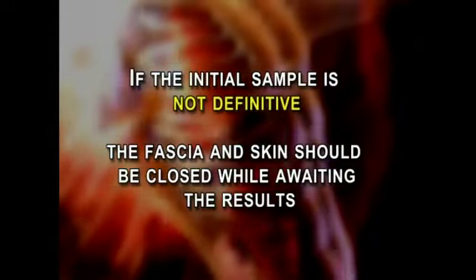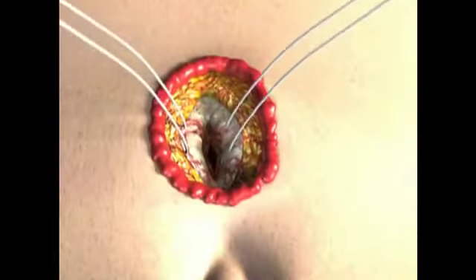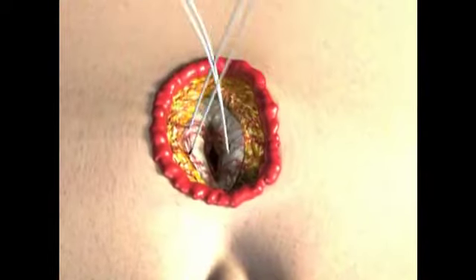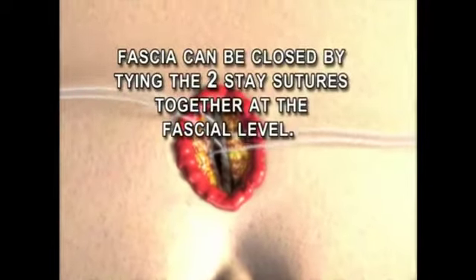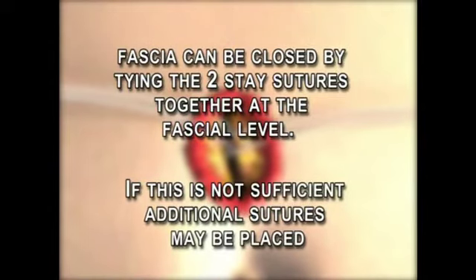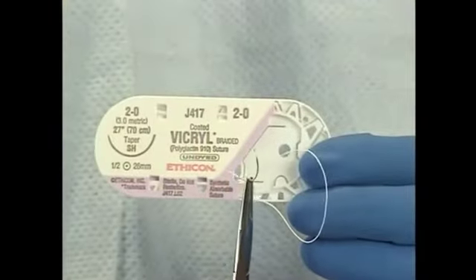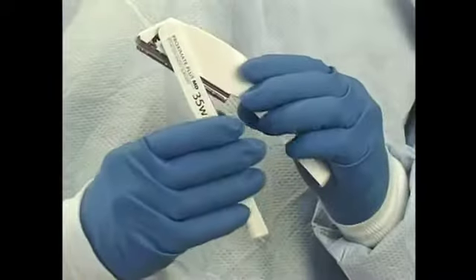The fascia can be closed by tying the two stay sutures together at the fascia level. If this is not sufficient, additional sutures may be placed. The skin may be closed with either sutures or staples.